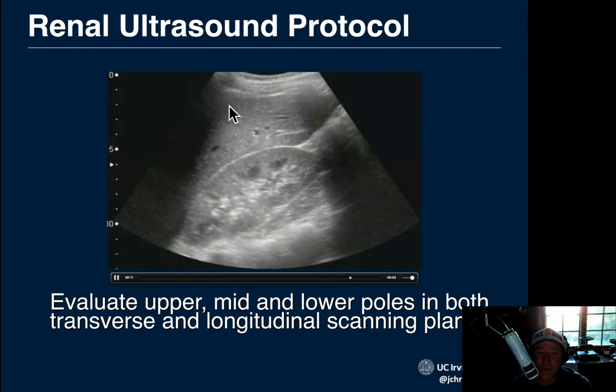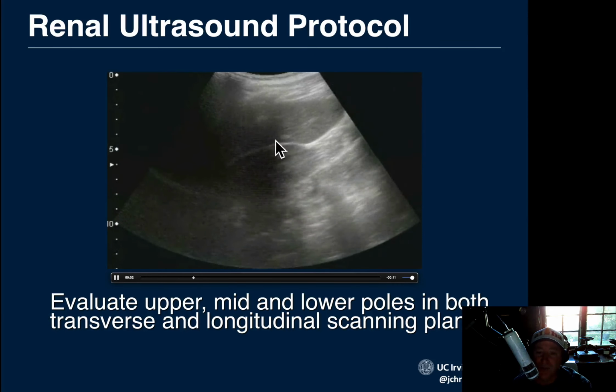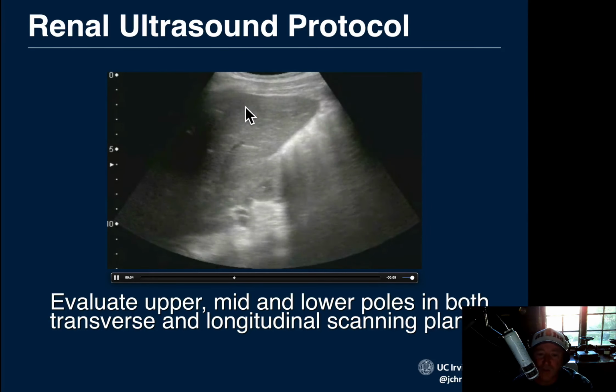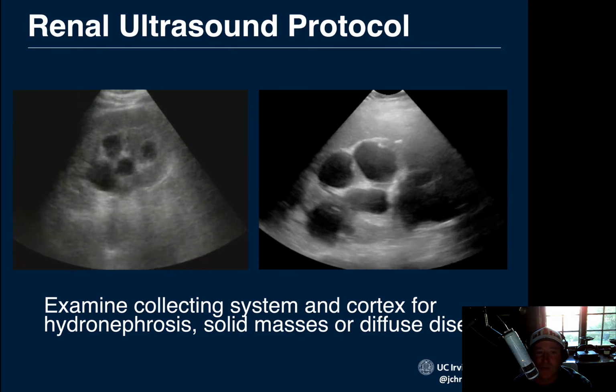This is the right kidney, obviously, because this is all the liver up here. Right kidney is always way easier to see than left kidney because of the liver. You can really get anterior approach, use that liver as your window to see the kidney. I mean, this is our Morrison's pouch. I think we're all very comfortable with that.